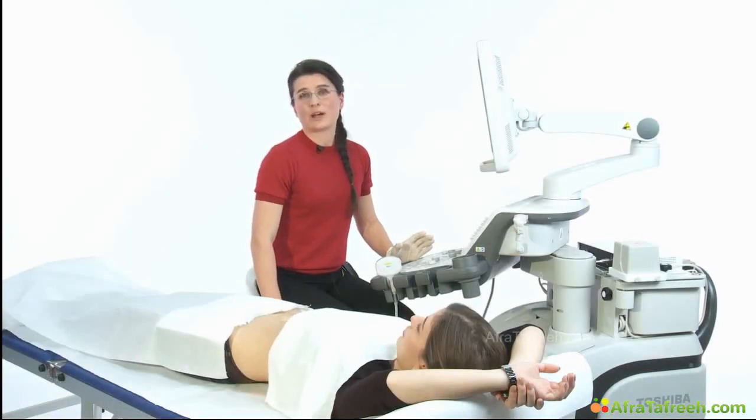So, if you got an ultrasound machine at the ward, just take a colleague and try it yourself. It's easy, we see, and it's rewarding. We got so much information in such a short time. So, just get on and try it for yourself.